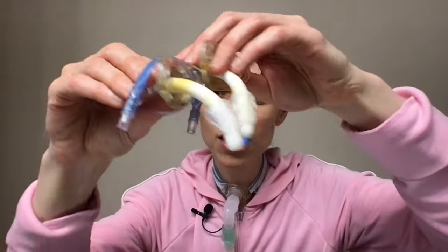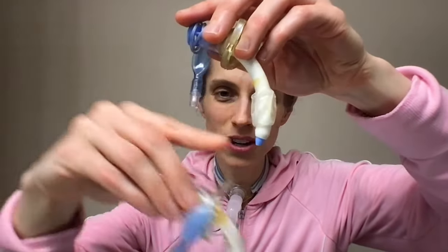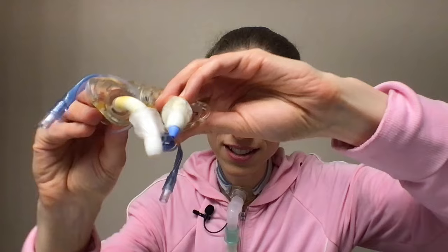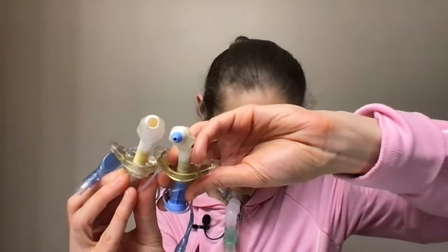Let me show you the difference between using the obturator and no obturator. If you look at that, you can see how this obturator gives us a nice extended point, and this one without it does not. You can see how the ends are right there. You can see how this raw end can get stuck, and this has a nice smooth end.